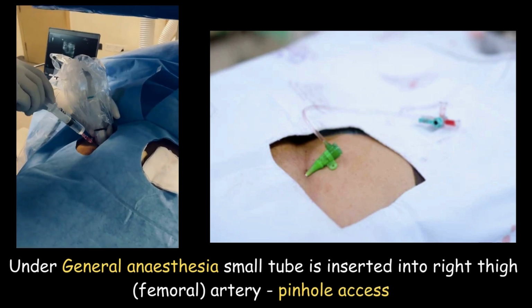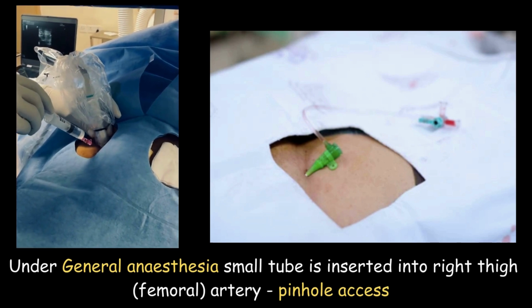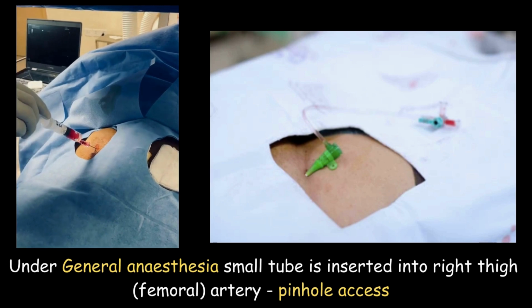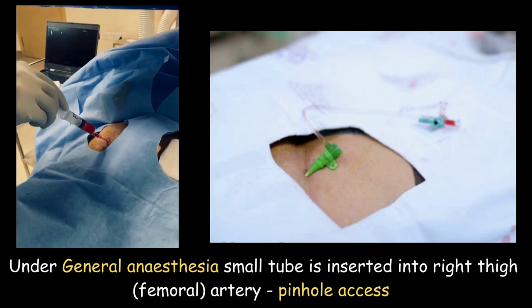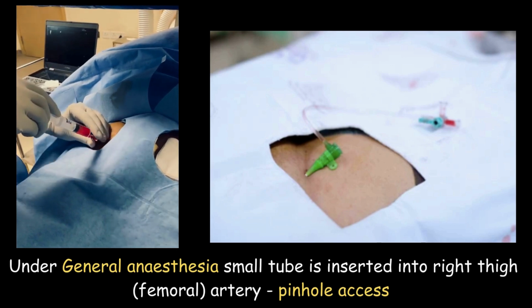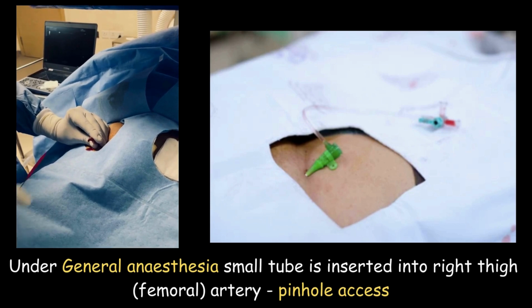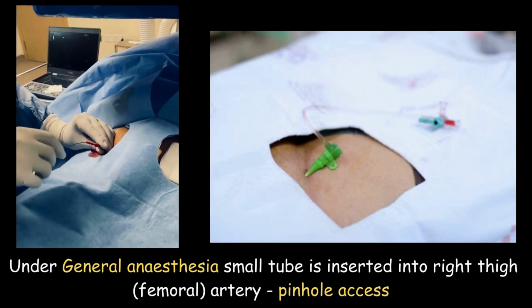Under general anesthesia, a small tube is inserted into the right femoral artery, which is a vessel running in the thigh. This is a pinhole access. You can see a green tube here. All the coiling, all the procedure is done through this small tube. There is no cut, no stitches, no suture, nothing. The entire procedure will be done through this small tube.